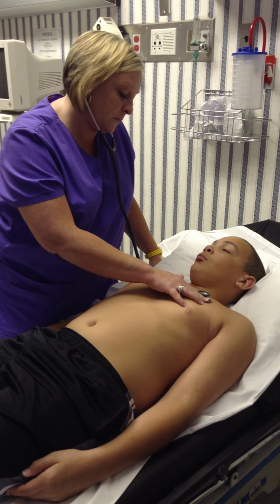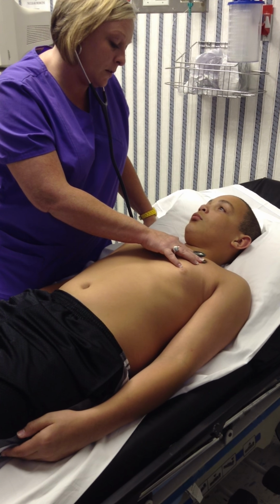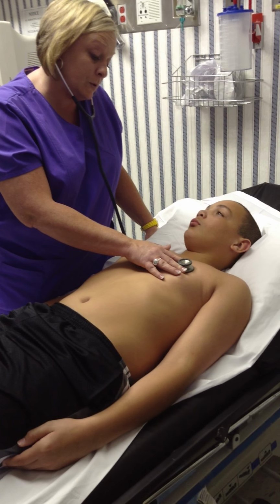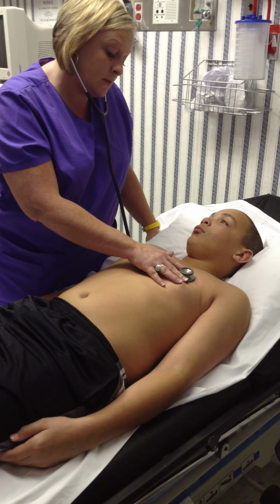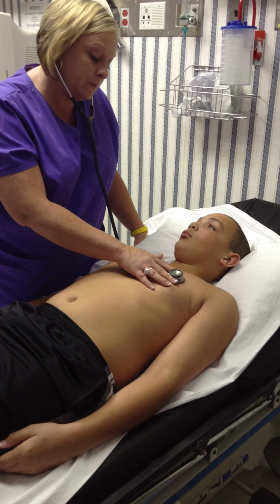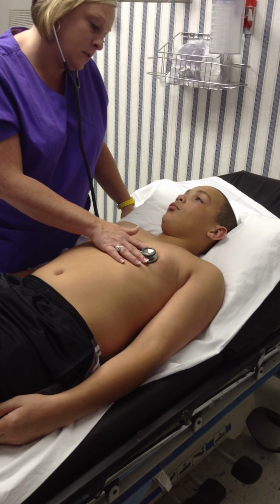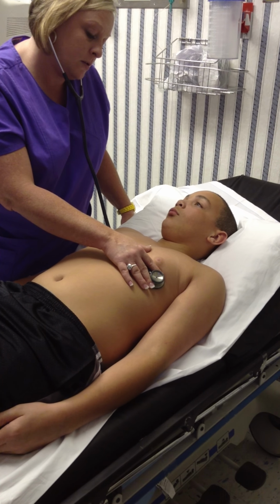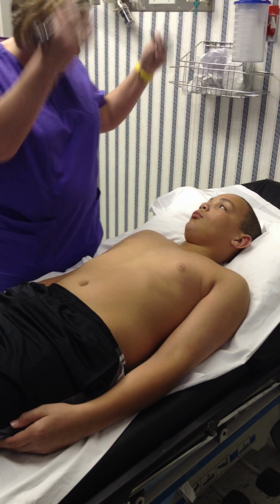Pulmonic. And the aortic and the pulmonic, S2 is greater than S1. And Erb's point, S1 and S2 are equal. And the apex of the heart, S1 is greater than S2. And Micah, that's all normal.